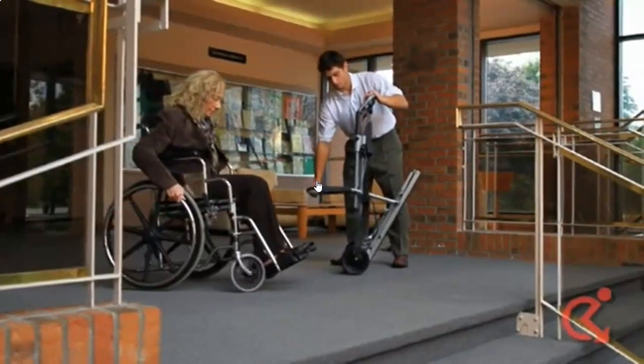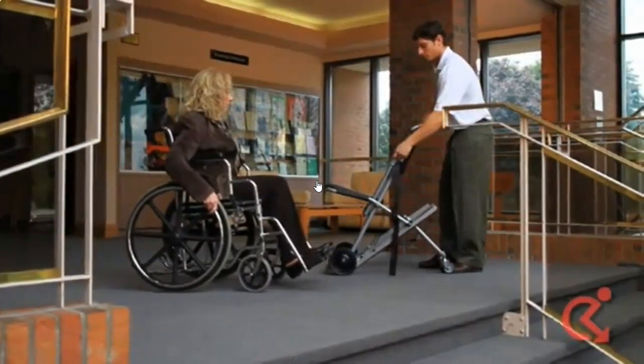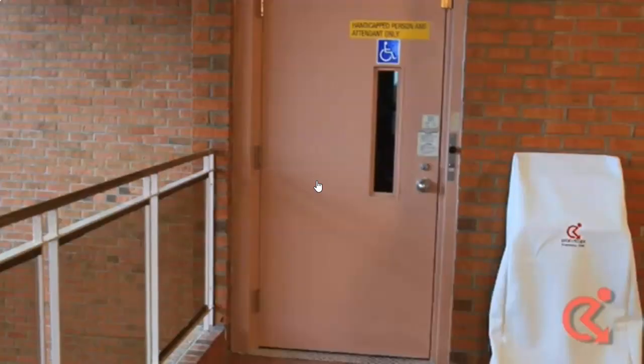The Evacuscape chair should be located in an area that is easily accessible in the event of an emergency. Examples include next to the handicapped washrooms and close to the emergency stairway.